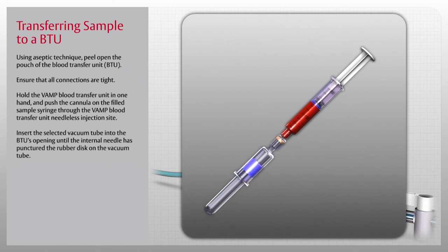Insert the selected vacuum tube into the BTU's opening until the internal needle has punctured the rubber disc on the vacuum tube.